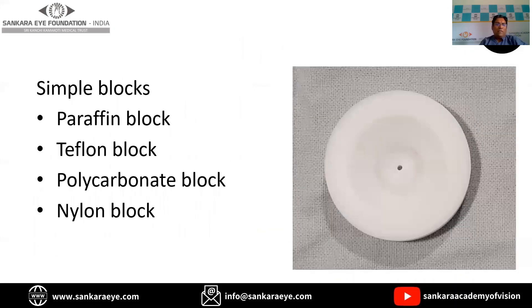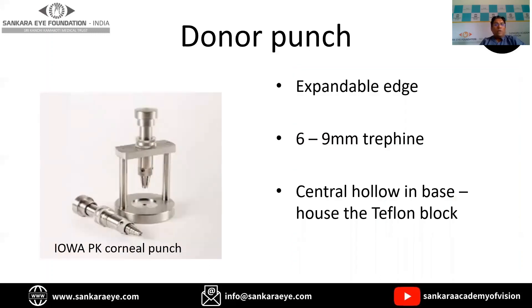This is the Teflon block shown here. It is mainly used for donor preparation, where the donor is placed on the Teflon block with the endothelial side facing up. This is the Iowa PK corneal punch, used again for donor preparation. It has an expandable edge, and a trephine from 6 to 9 mm can be kept on this. It also has a central hollow which houses the Teflon block.